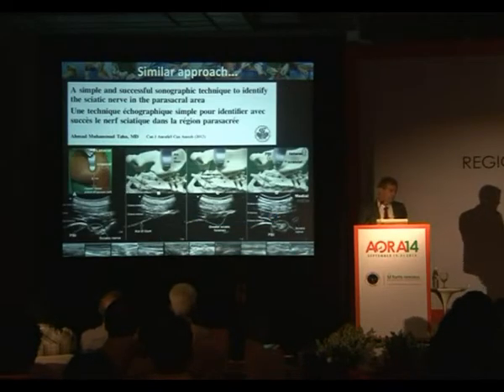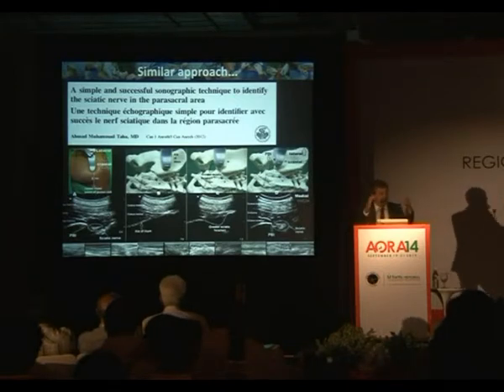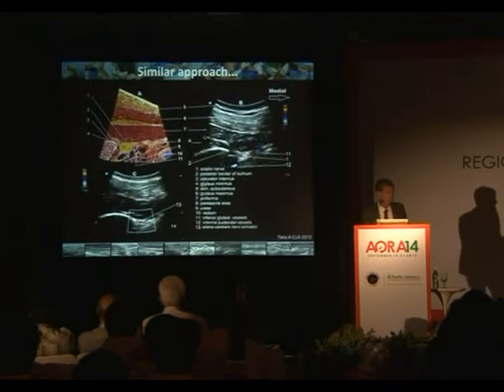When you go to the literature, there is a similar technique described by Mohamed Taha. The main problem is performing the block here, putting the probe here. So he's performing it just in the part where you have a big hole and where you can go to the pelvis, and he describes the possibility of this complication himself. Here, you have a lot of traps, you have the rectum, you have the ureter. So I think this is not the good level to do it.